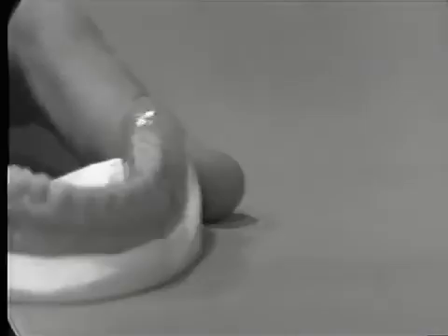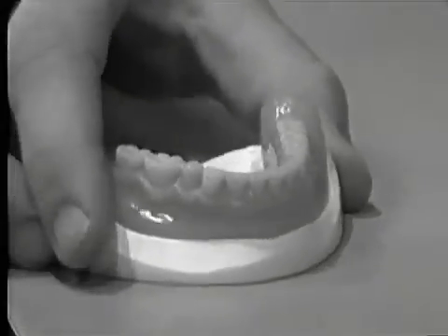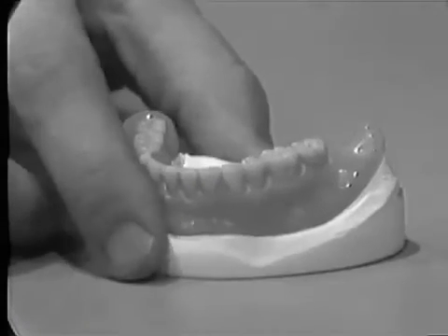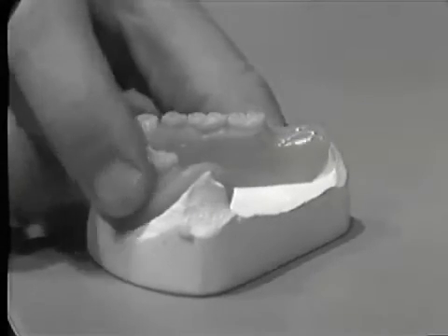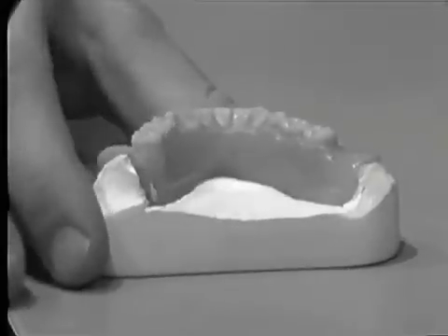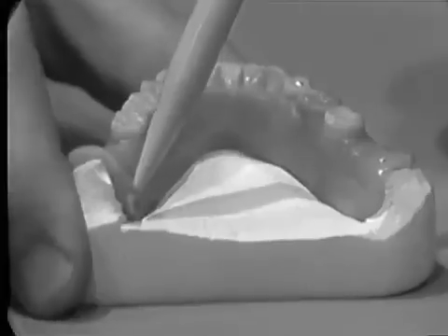Mandibular remount casts are fabricated in the same manner. Again, as with the maxillary denture, it is important that the borders be visible around all the mandibular peripheries. Special attention is placed on cleaning the tongue space of any excess plaster.